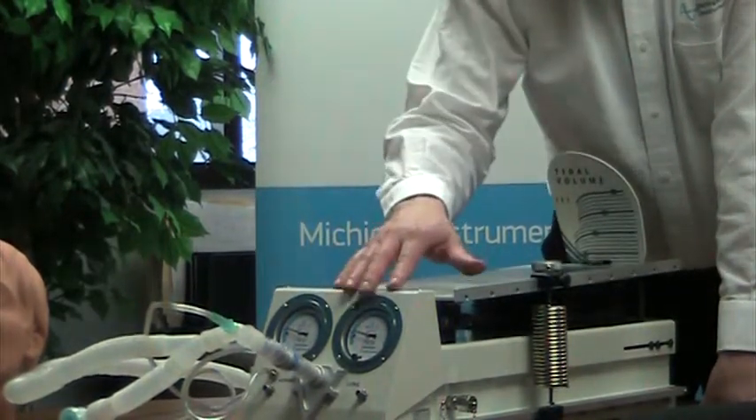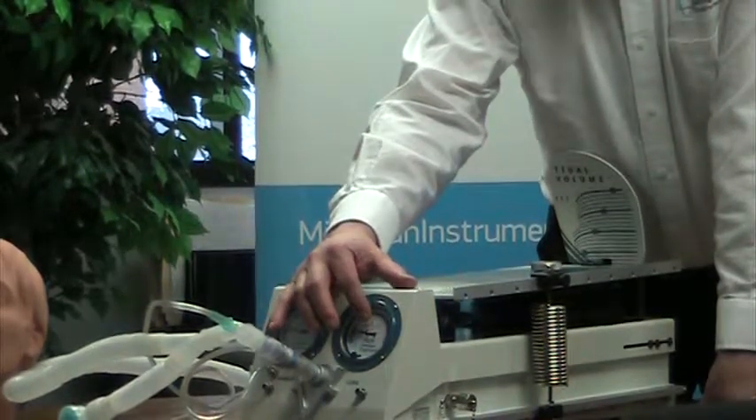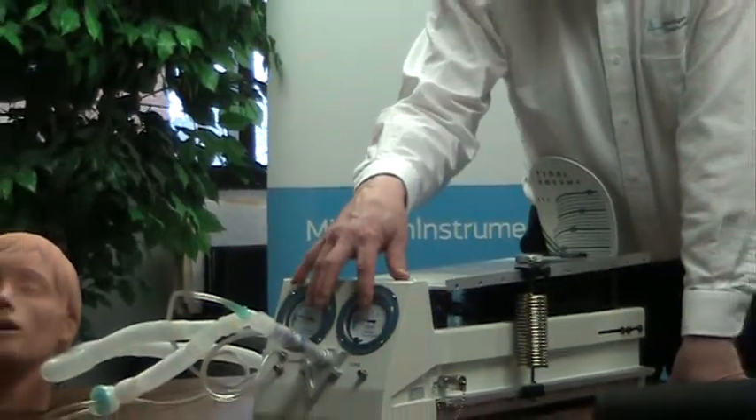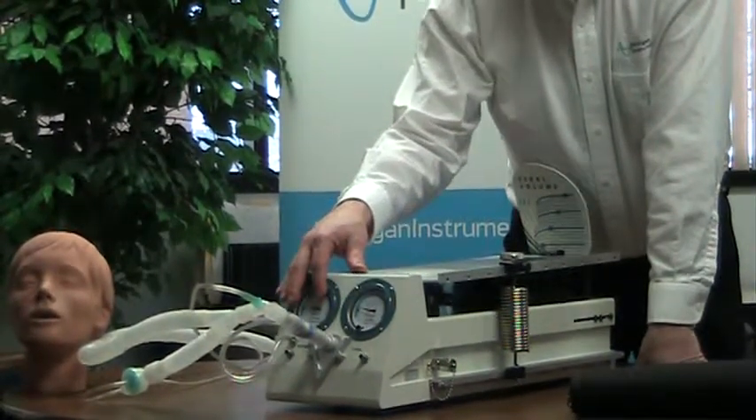Our lungs incorporate two pressure gauges to both measure the pressure in the lung but also the pressure at the airway.